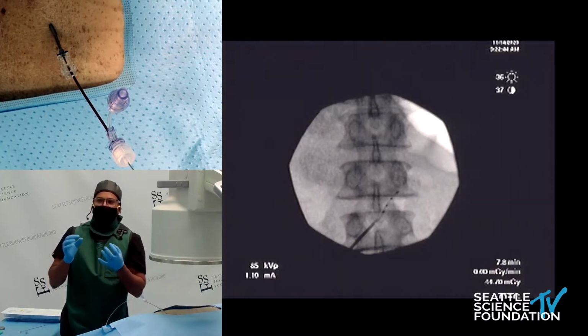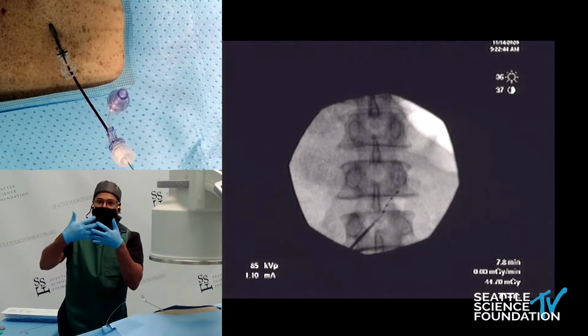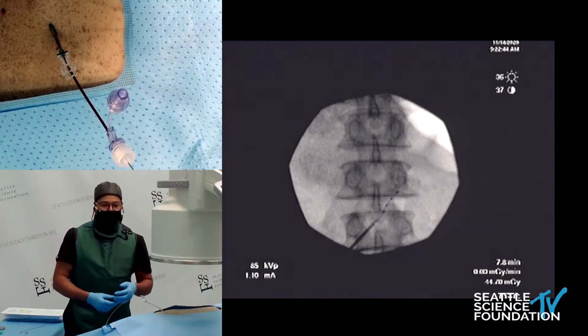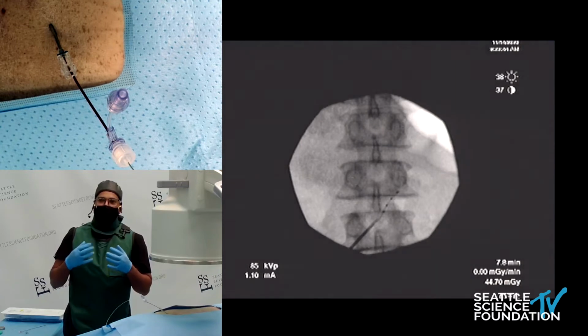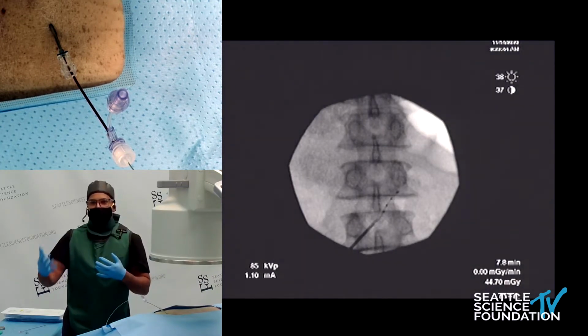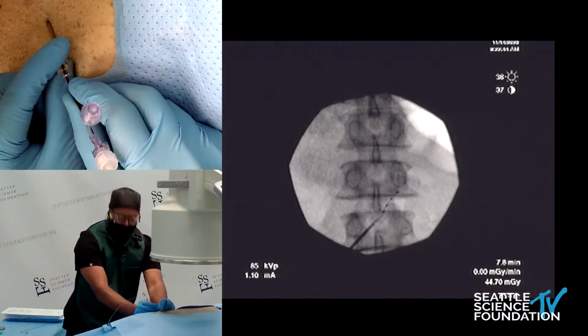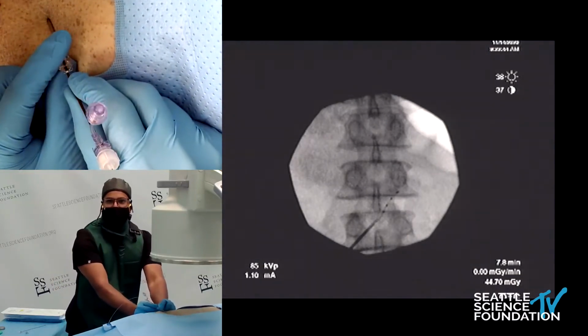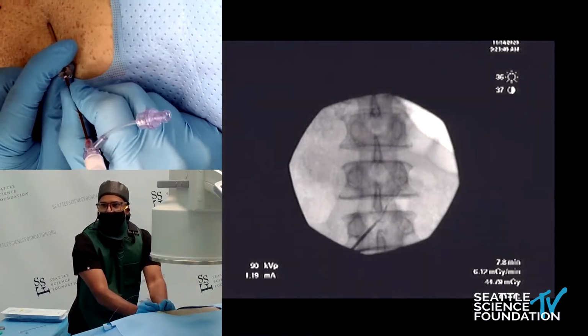And it does have some rigidity, but we also know that we don't want it to be too rigid so that it actually dings the nerve, because that nerve is actually being suspended in those ligaments. So it's very common for patients to feel this, to feel a paresthesia. I really recommend talking them through this and not over-anesthetizing, because that could hurt you down the road. So there are a few ways of going about this, and again, this is usually not as rigid in the real world or with a live patient, but with cadavers, we often see this.